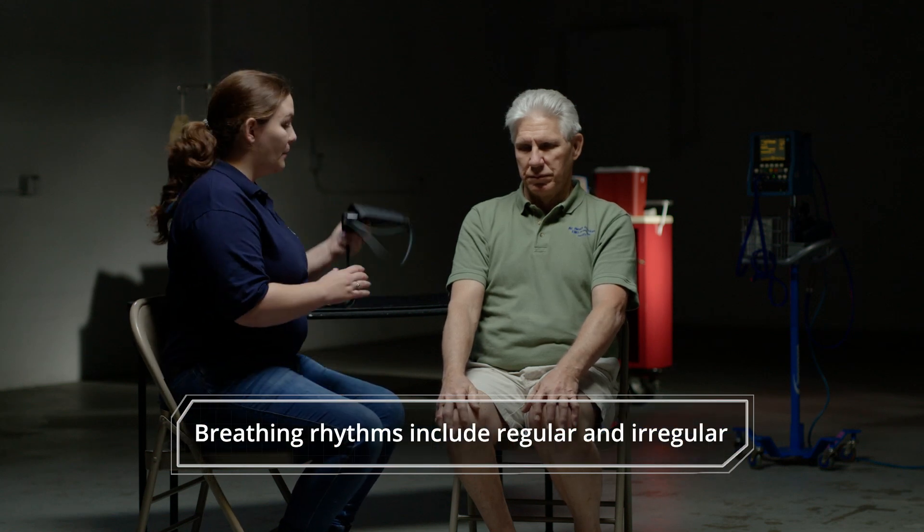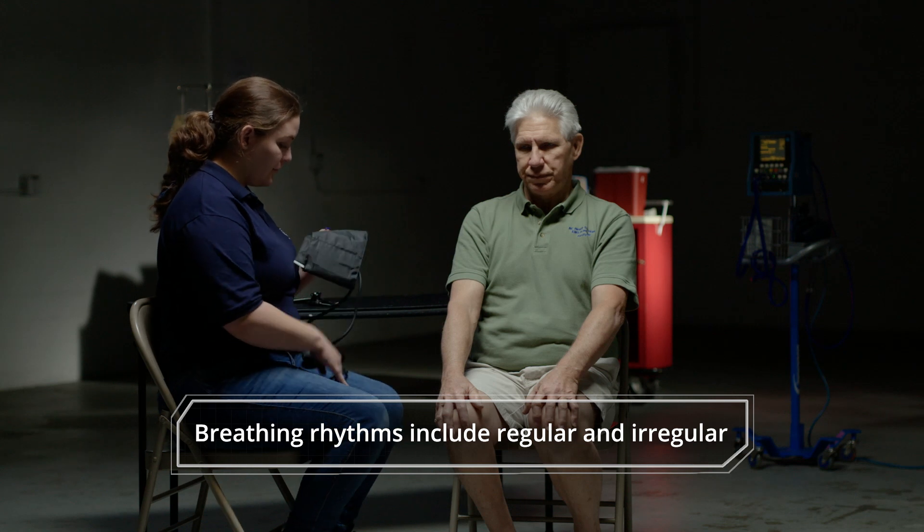Now I'm going to palpate a blood pressure using the blood pressure cuff. I'm going to take the blood pressure.